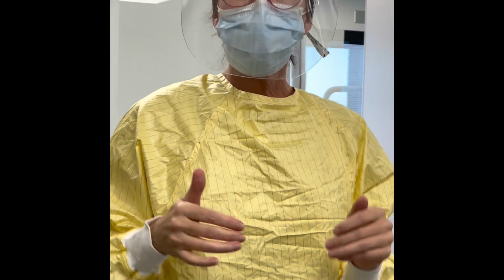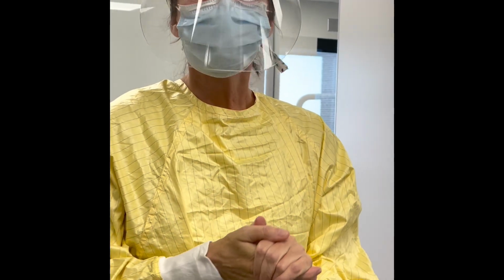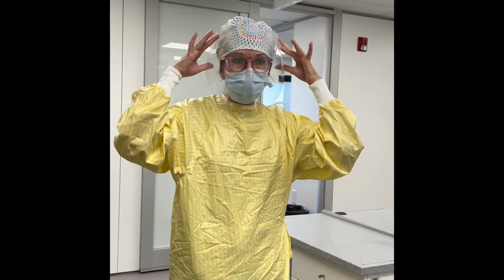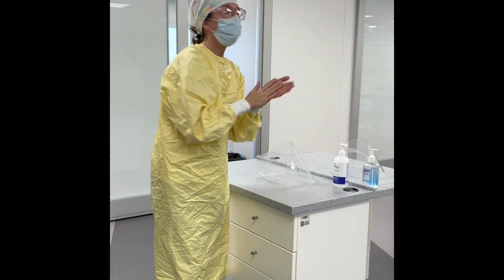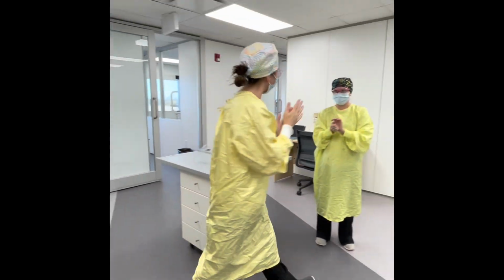Okay, next what I would do is another subsequent hand hygiene and then put my gloves on, and then I would go and sit at my unit. Because this echoes so badly for the purpose of the video, I'm not going to wear it. So what I'll do is I'll just do a gel. I'll head back to the unit, get my gloves on, and we're ready to start.